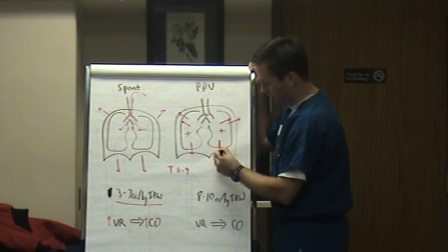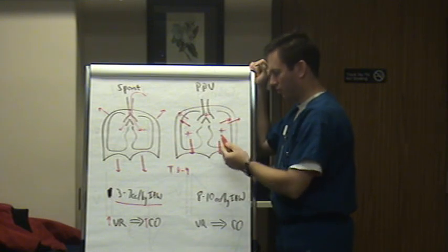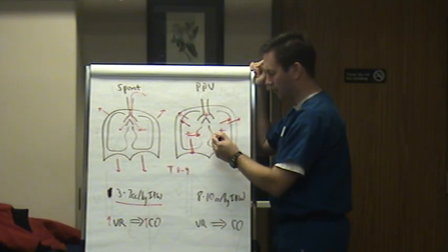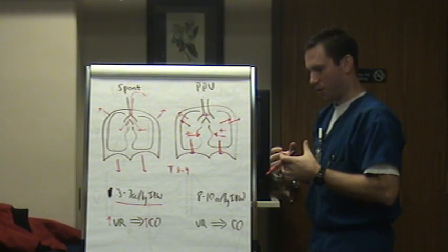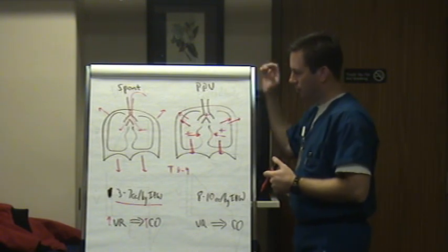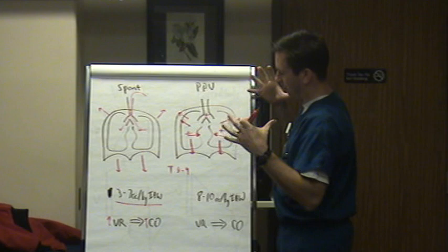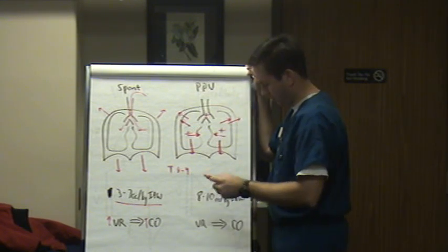Now, here's what we forget to think about. We're pushing this pressure out, down on the diaphragm, but unfortunately, what structure are we also pushing inward on? The heart. So that's a strike against us as soon as you intubate somebody, assuming they're paralyzed. You are pushing just as much pressure on the mediastinum and the heart as you are to make the rib cage rise. So a lot of times, if your patient has poor vasomotor tone or they have very little reserve or blood pressure issues, you're going to come into a problem, because if you give this patient a large enough pressure or a high enough tidal volume, what do you think you might be doing to venous return at that point? You're going to be dropping it.